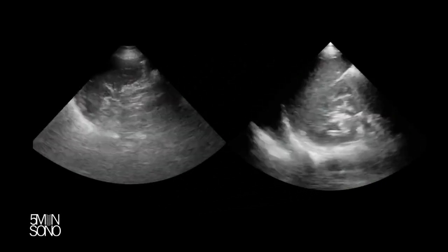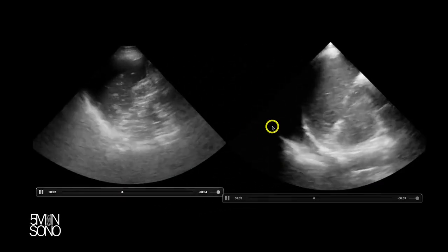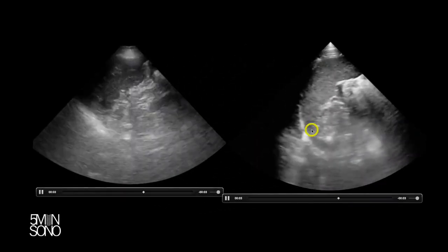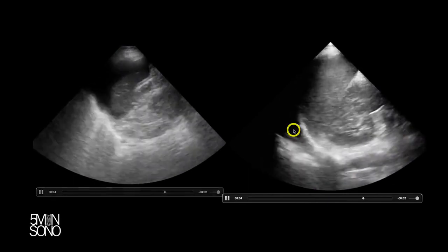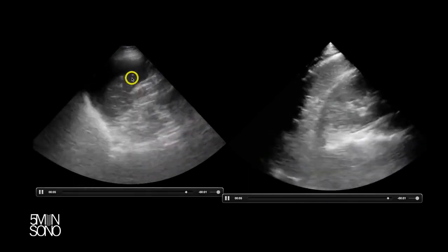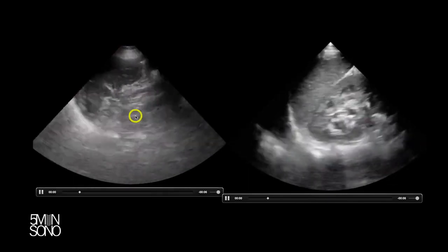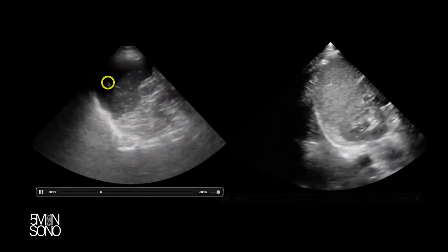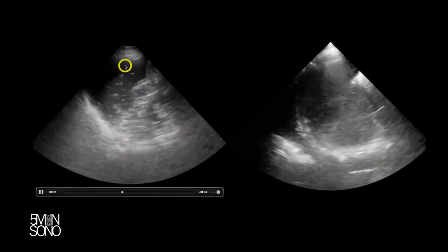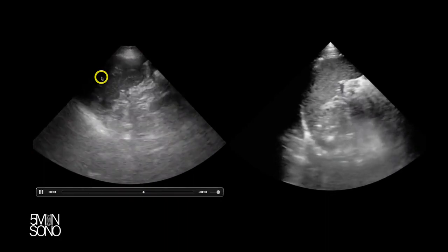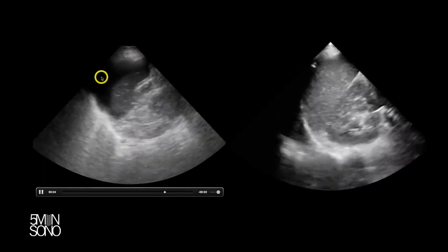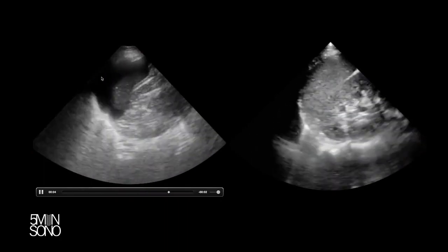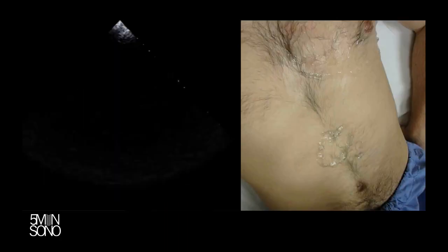On the right side of the screen we have a negative left upper quadrant FAST. And on the left side we have a spleen, a kidney down here, and a bunch of free fluid up here — this is what a positive left upper quadrant FAST looks like.